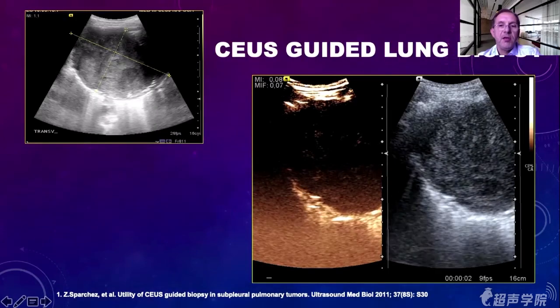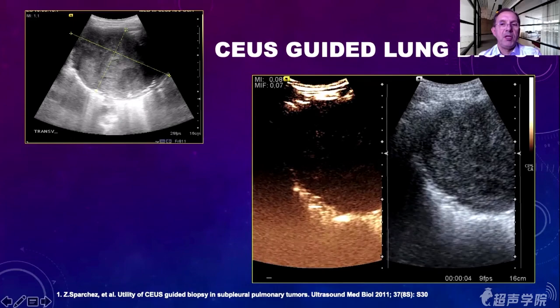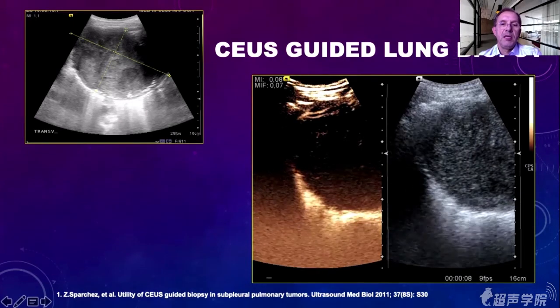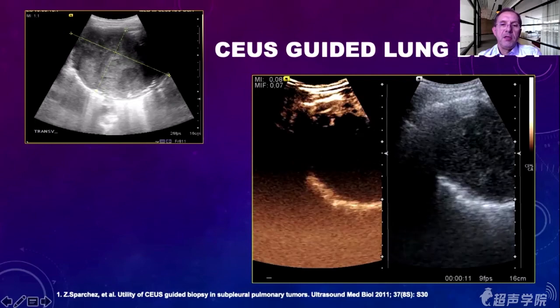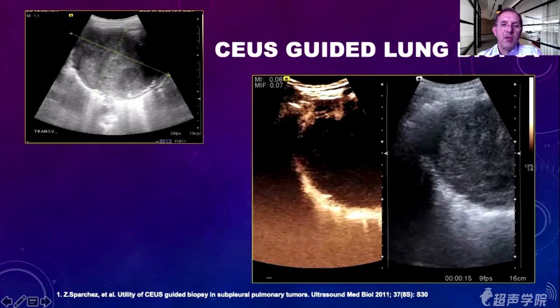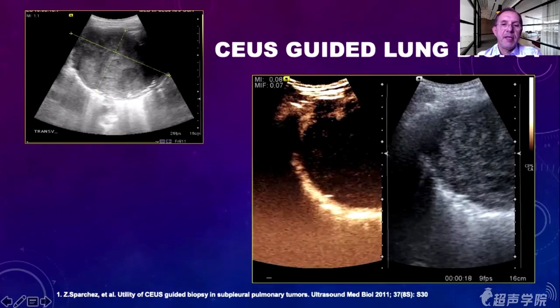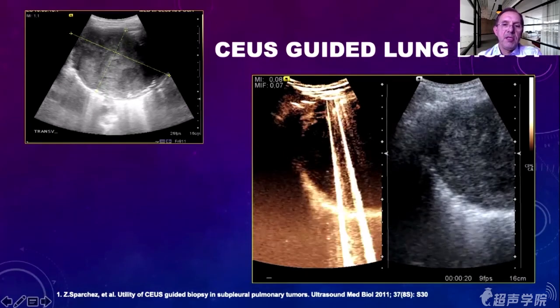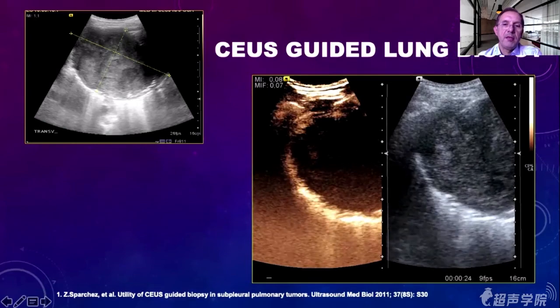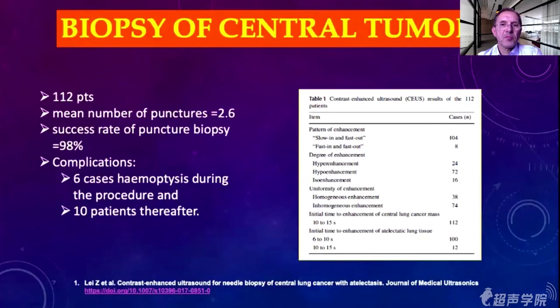And you see here in this example a large tumor in the lung, and you see here the extent of the necrosis. So it was 80-90% necrosis. But using the information of contrast, we may insert a needle in the active part of the tumor, and we may sample viable tissue.